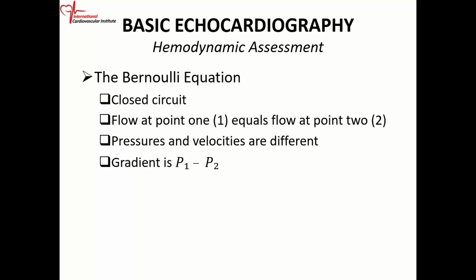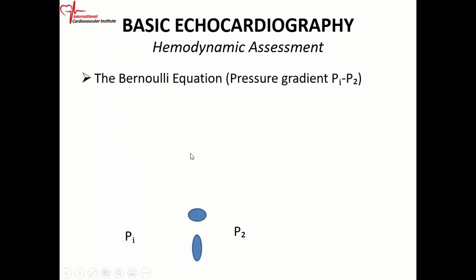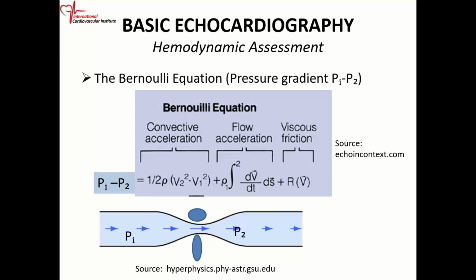So the Bernoulli equation allows us to calculate gradients. And gradients are basically the pressure difference which allows flow from one direction to the next. All right, so let's look at it in a little bit more detail. So this is what we're talking about.